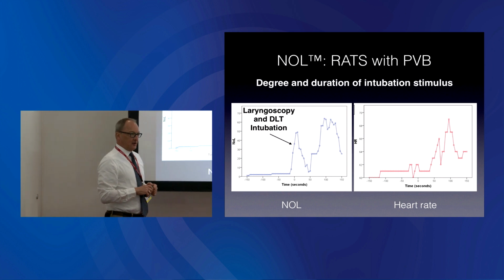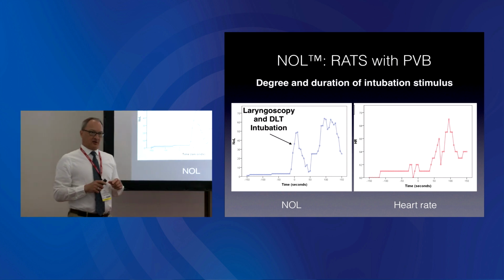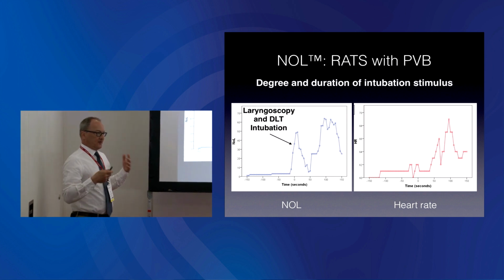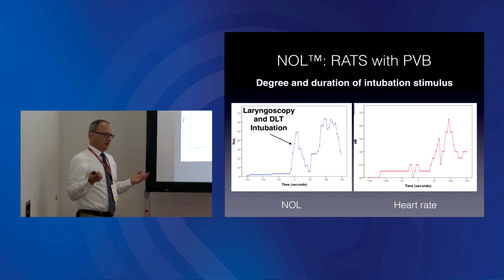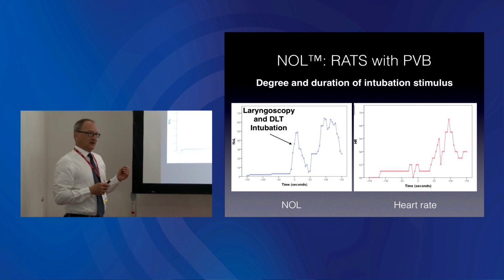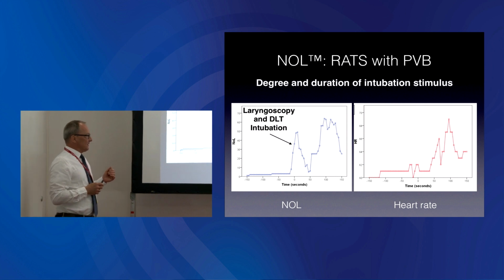Another thing which was said earlier on is the heart rate as such. We're saying the heart rate is an indicator of stimulation, but a very bad one, because it's very much variable and is a small signal change. And this is just a reflection.